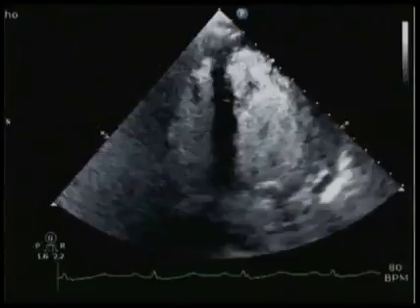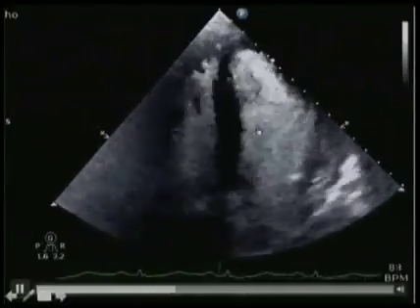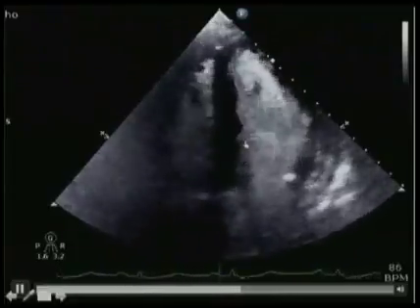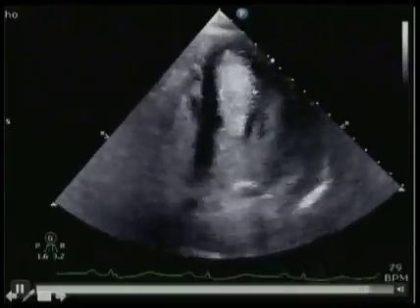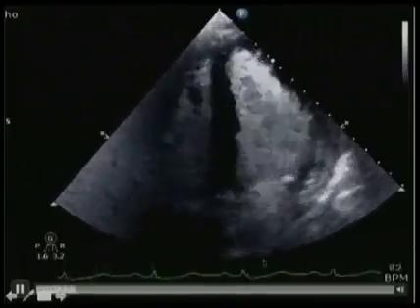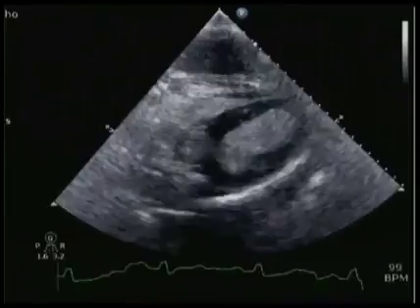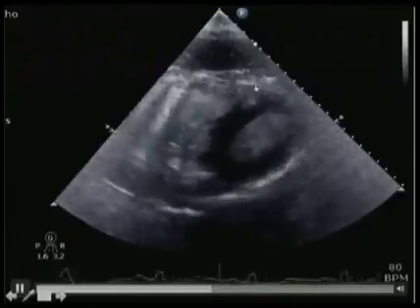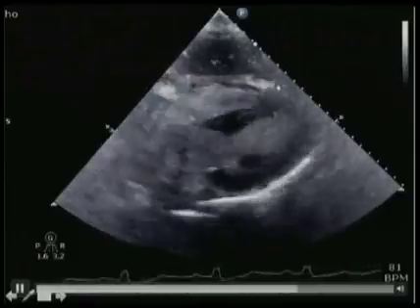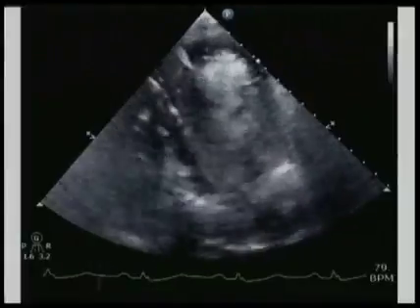And here's the contrast image. And again, you can see the lateral wall moves well. The septum is hypokinetic at the base, akinetic out here at the apex, but there's no thrombus seen after we give contrast, which is quite encouraging. On the other hand, it was a little bit surprising to see in a subcostal view that there was some contrast in the pericardial space, and you see that right here. That doesn't belong there. It makes us worry very much about an LV pseudoaneurysm.